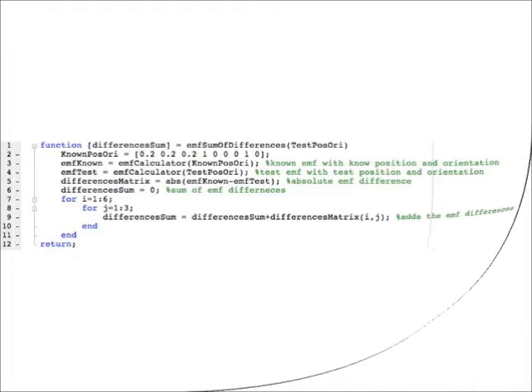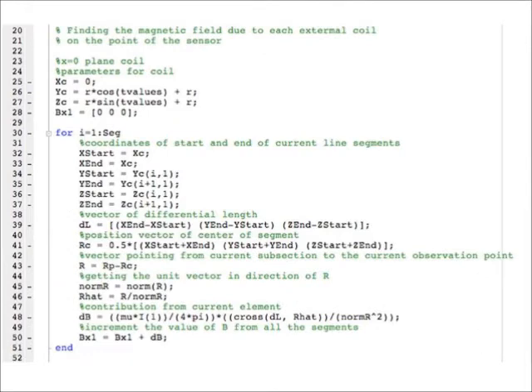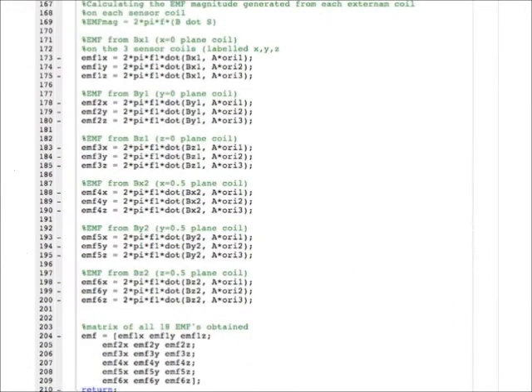This is the Matlab code for the EMF calculator. Each external coil has different parameters. There are 6 for loops calculating the magnetic field from each coil at the sensor. Here, we calculated the EMFs at each of the 3 sensor coils. Since there are 6 external coils, we will end up with 18 EMF values.